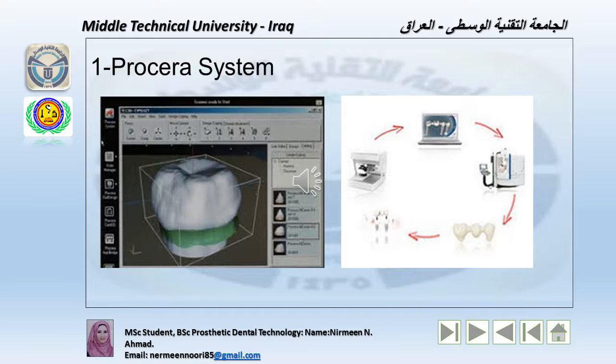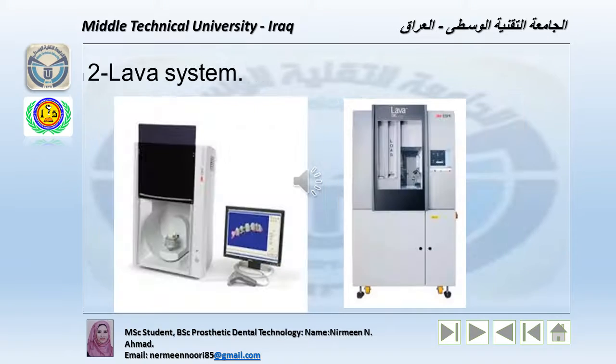It is very technique sensitive because the degree of die enlargement must precisely match the shrinkage produced by sintering the alumina or zirconia. Excellent clinical longevity and strength. The scanning machine is manual, the CAD program is custom design with a database, and the CAM process is fully automatic.